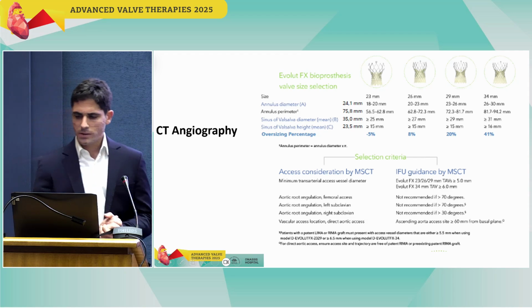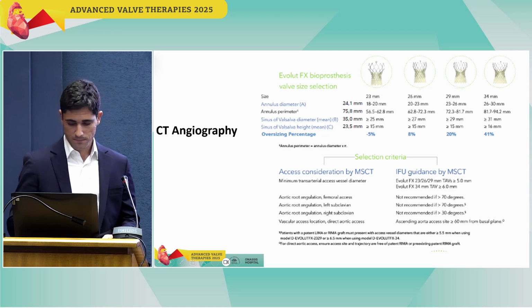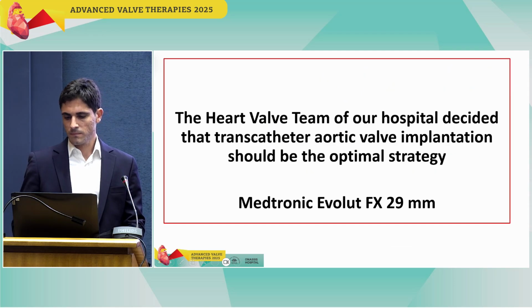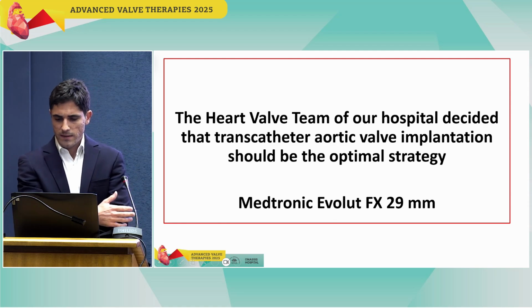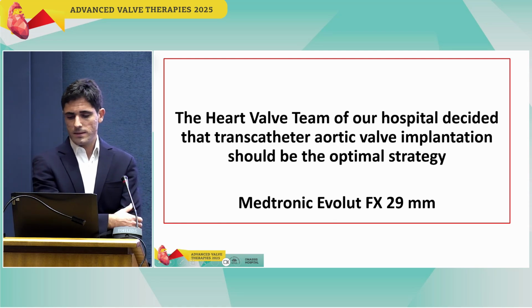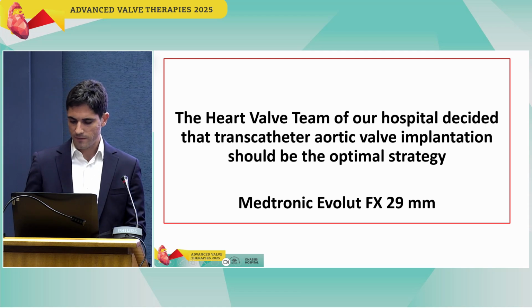Proceeding to the valve selection, through CT angio, we selected the 29 millimeter Evolut FX. The heart valve team of our hospital decided that transcatheter aortic valve implantation should be the optimal strategy, with a Medtronic Evolut FX 29 millimeter valve.